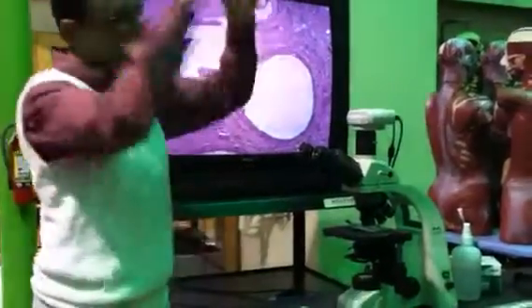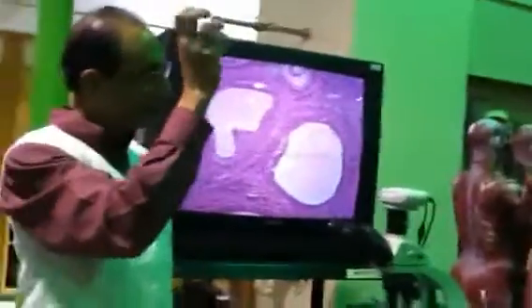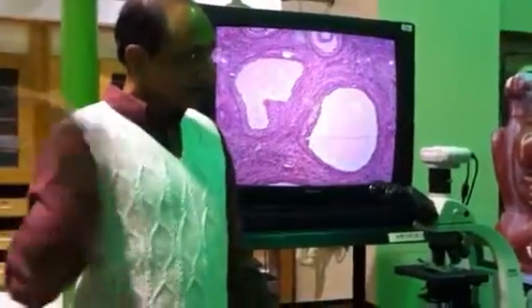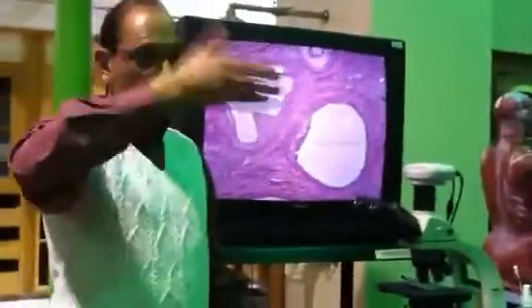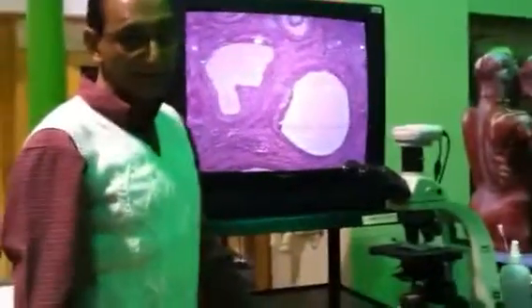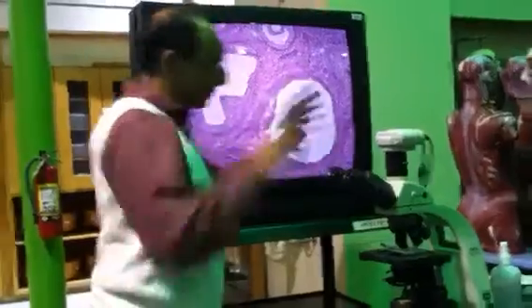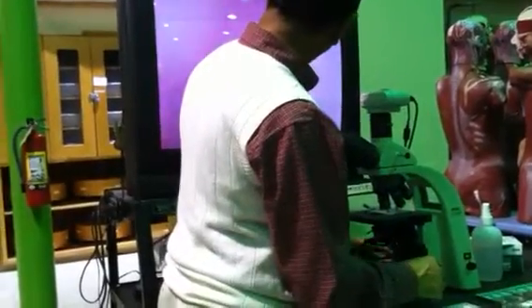Because it is like a sphere, like a ball. It's a smaller ball hanging there, like the oocyte. So if you cut like this, you don't see that, unless the cut is going through that oocyte. It's like a ball within a ball. So this follicle is big. All right. So you will see here two layers. Let me show you those two layers in more detail.